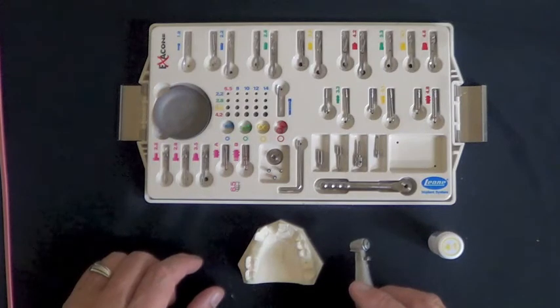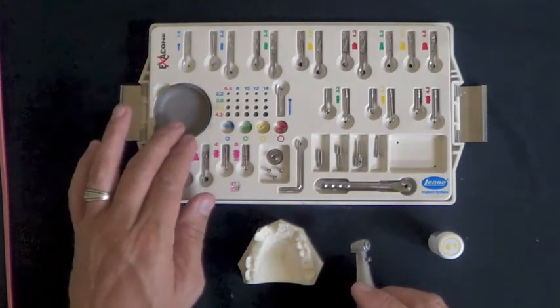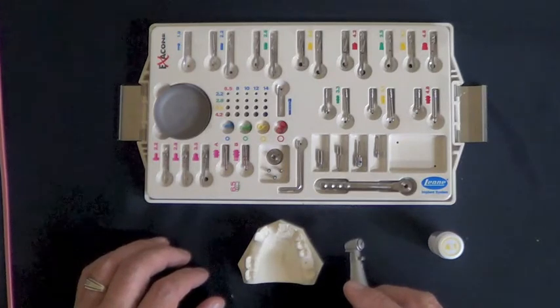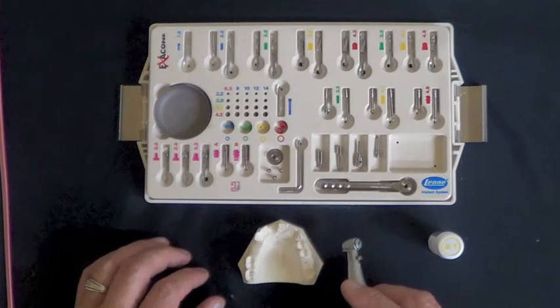Hello, I'm Dr. Moline. In this short surgical video, I would like to demonstrate how to use the Leone Surgical Kit, place an osteotomy in a model, and insert the implant and the steps involved in that process.